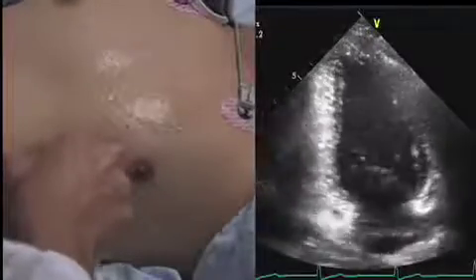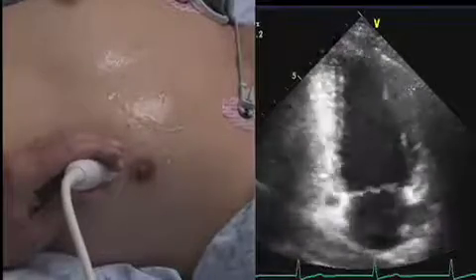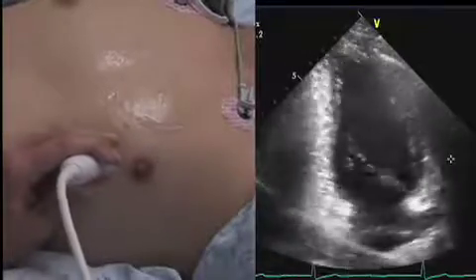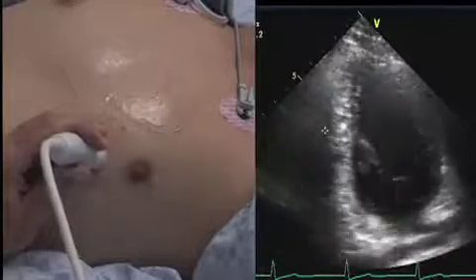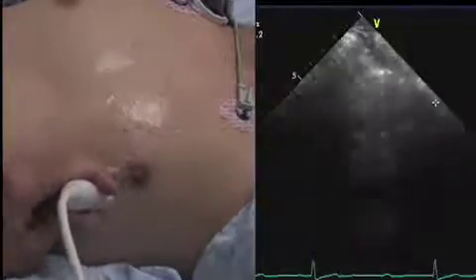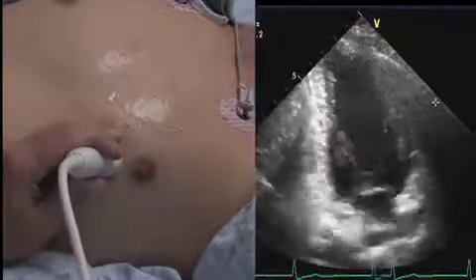Let me switch over to the two-chamber view. Quite often, one wall or the other will be difficult to see. We want to make sure we're seeing them both well, and in that case you may need to just change your position on the chest, change your angle a little bit. Often it's the inferior wall that is well seen, and the anterior wall is not so well seen, as we can see here — it's falling out. So by doing a circle survey, I may be able to stumble into a nicer view of that anterior wall.